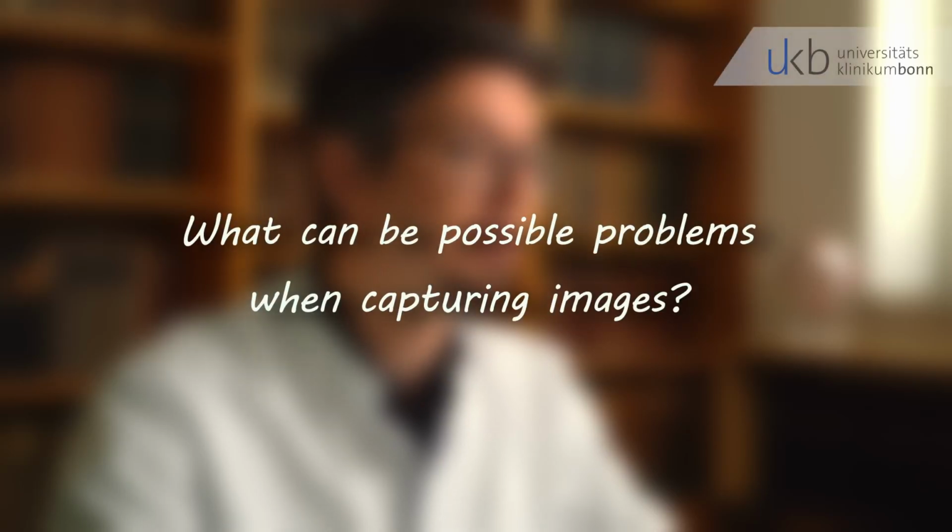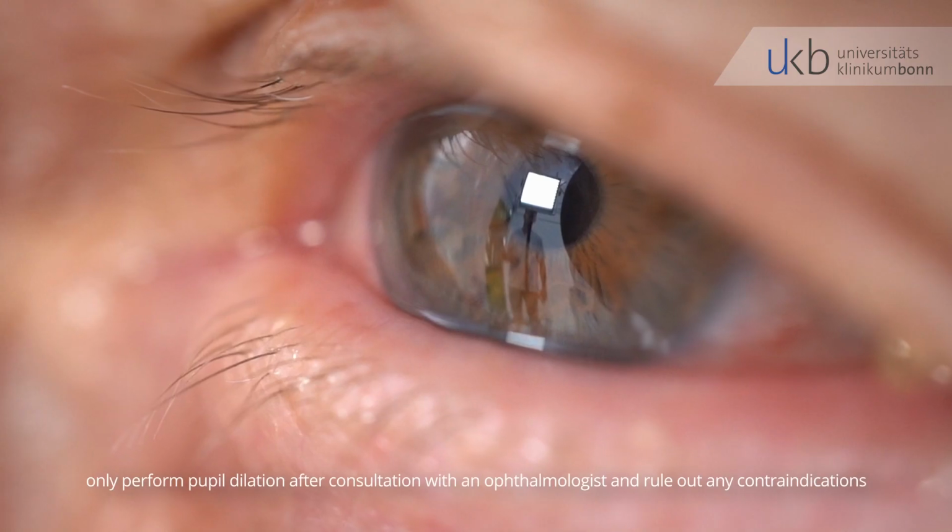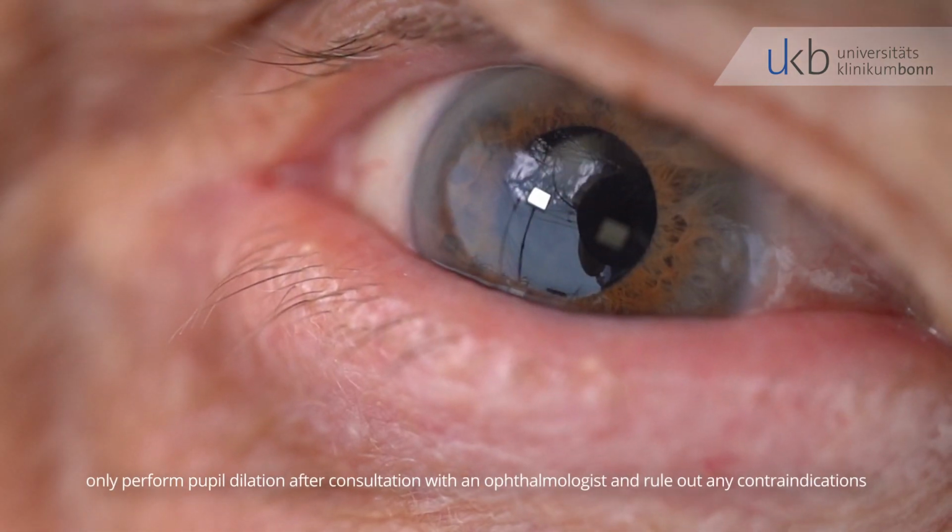What can be possible problems when capturing images? Make sure the patient's pupils are well dilated. Otherwise, you might encounter problems as the examination gets more challenging in general. You might also not be able to achieve full field of view and a sufficient illumination. So, always make sure that the pupils are well dilated.